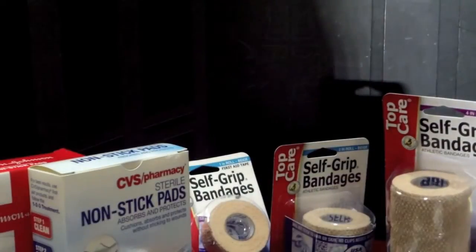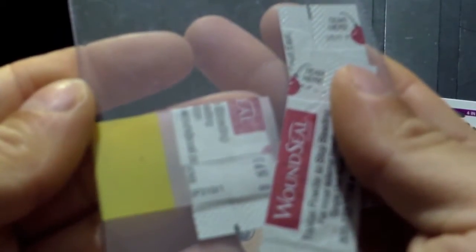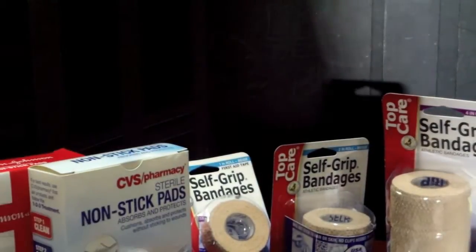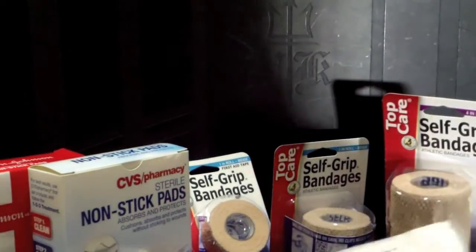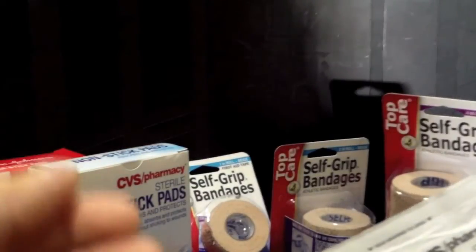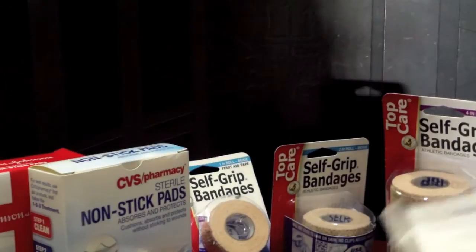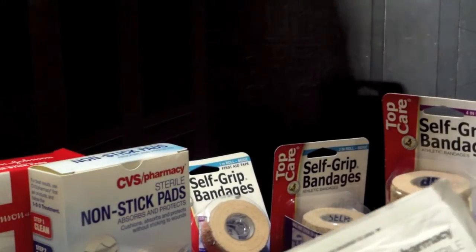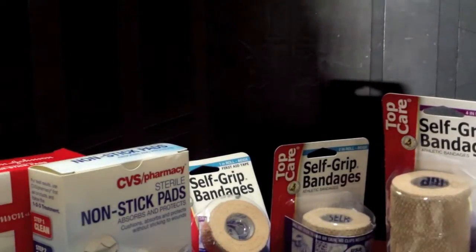The reason why I have new ones, but I also have one you can see perfectly cut and sealed, is again that one-hand use. It's very clunky when someone's hurt, that you pull out this detailed first aid kit, unwrap things, and you're trying to slowly help them, and they're in discomfort, and in some cases time is of the essence.